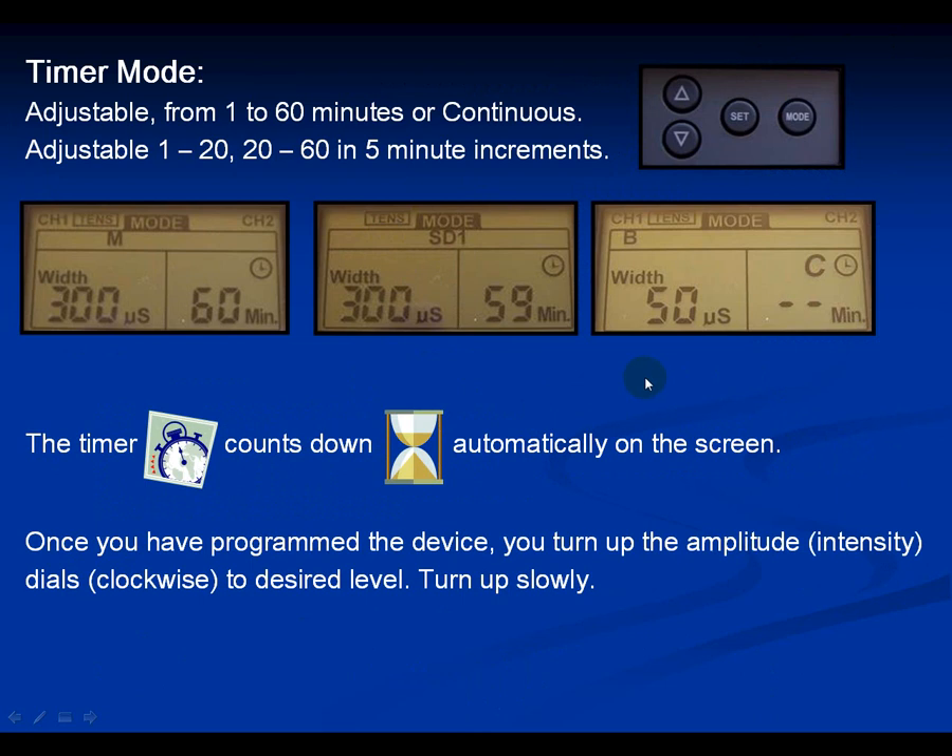The timer mode works as follows: push the mode button, select the mode you want, then hit the set or selection button until you get to the timer where the number is flashing. It goes from 1 to 15 minutes in 1-minute increments, then in 5-minute increments up to 60. C means constant, and two dashes means the device stays on until the battery dies or you turn it off.